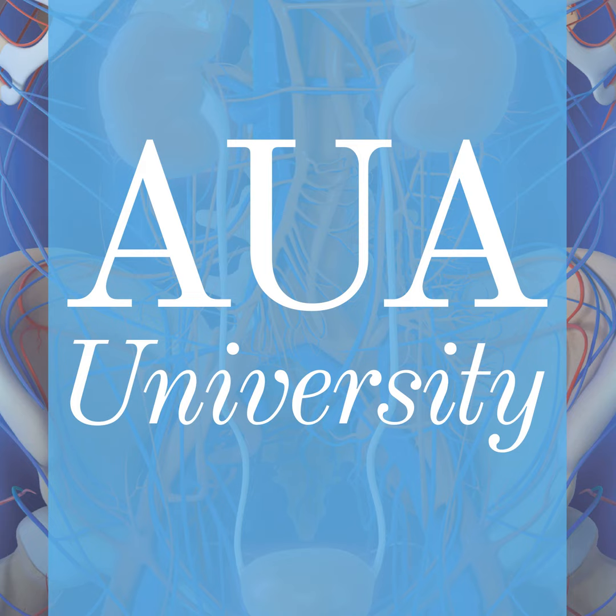There is a normal physiological distribution of the gallium PSMA PET tracer, and you can see it on this image. You have a moderate activity in the salivary glands. You have a moderate activity in the liver, the spleen, and the proximal small bowel. Whenever you use gallium PSMA, you will have moderate activity in the bladder. You always have a strong activity in the kidney, and these differences in activity, spleen and liver, kidney and bloodstream, will then be analyzed in the PROMISE score, which I will show you at the end of the presentation. Those might be the pitfalls of PSMA PET CT scans.